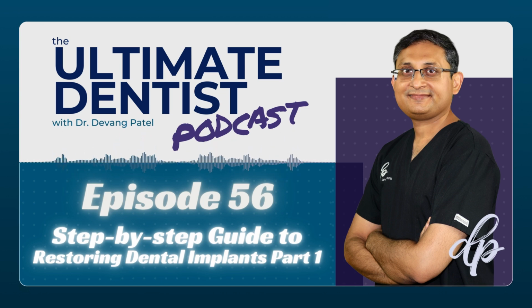The other option is, let's say if you are replacing upper left one and upper left 2 and upper right one, they both are crowned, which needs changing. So in that case, you can take those old crowns out and give patient a fixed bridge temporary from upper left 2 to upper right 1 to replace upper left 1. And that's temporary. So every time patient comes in, you take it out, you cement it with Tembond or temporary cement material, and you take it out and in every time patient comes in, do your stuff, and then put it back in again. And that's how patient can get fixed bridge.